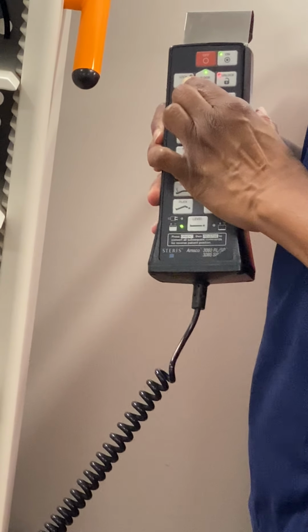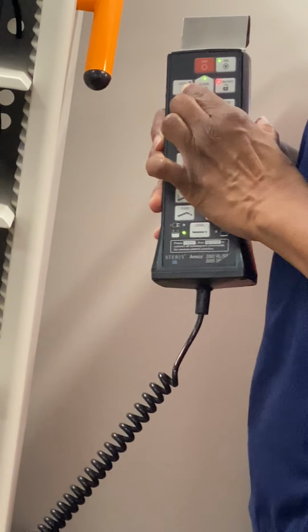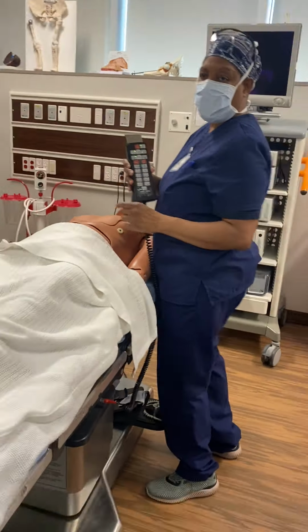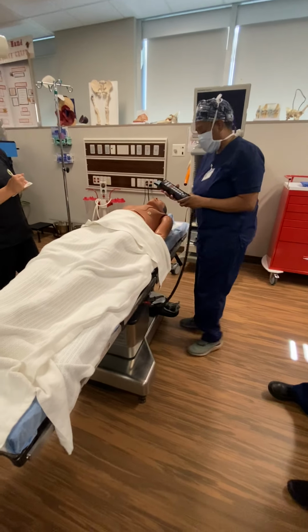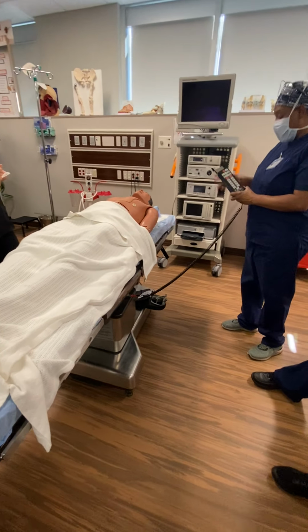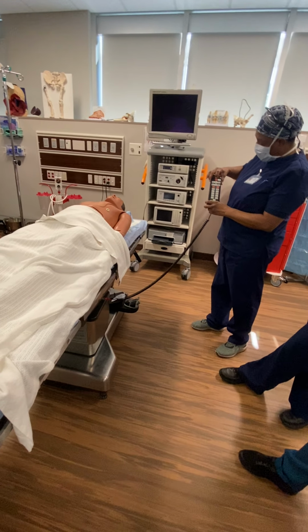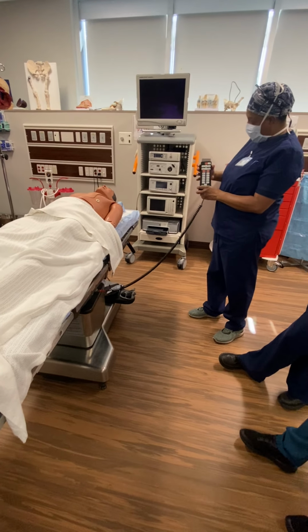You may have to hold it down until it locks. You may use a blanket, or you may use an egg crate. Today, we're going to use an egg crate, and it'll stop. All we're going to do is make sure that when I'm moving, it's not moving, okay? So if I'm way down here, and I'm trying to put his arm here, what's going to happen?